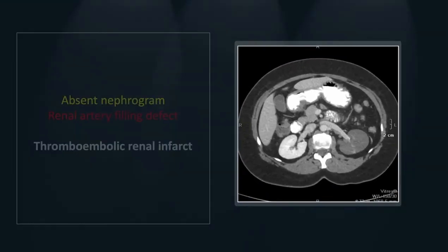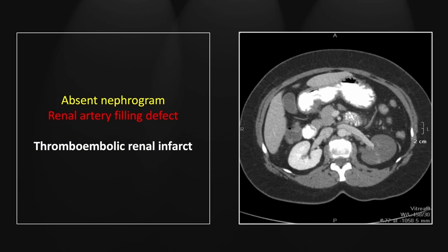Our next case is a straightforward thromboembolic renal infarct. I like this case because of the extent of loss of the left nephrogram and the visualization of a filling defect in the mid and distal left renal artery, which, although tortuous, is still viewed nicely in plane here.